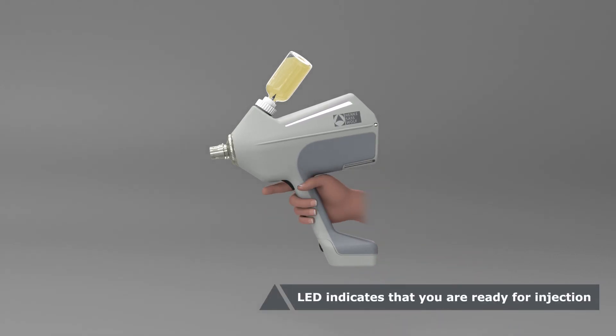After priming, readiness for the first injection is indicated by flashing white LEDs.